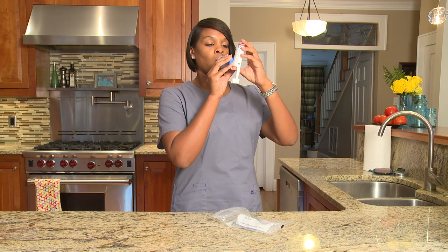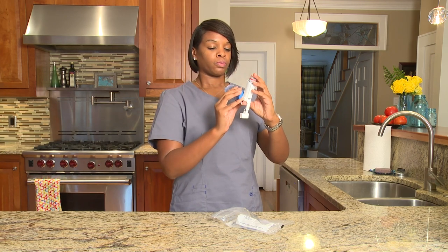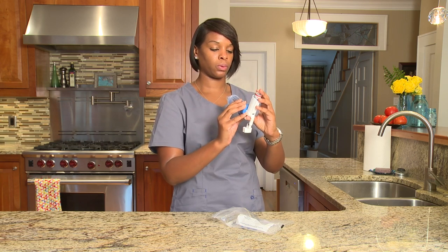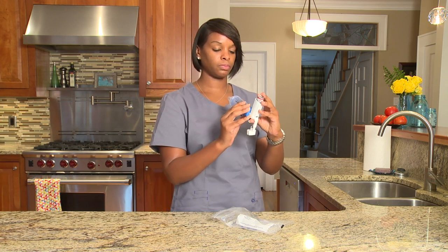Your dose of medicine is sometimes called a puff. Next, take a slow deep breath through your mouth. If the spacer whistles like a harmonica, you are breathing in too fast. Hold your breath for 5 to 10 seconds. This lets the medicine go deeper into your lungs.